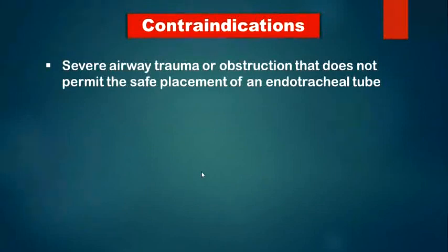So what are the contraindications for the intubation? If there is severe airway trauma or obstruction that doesn't permit the safe placement of the endotracheal tube.